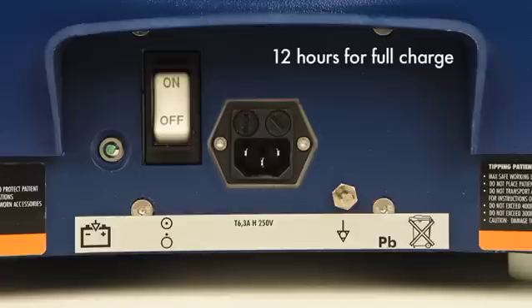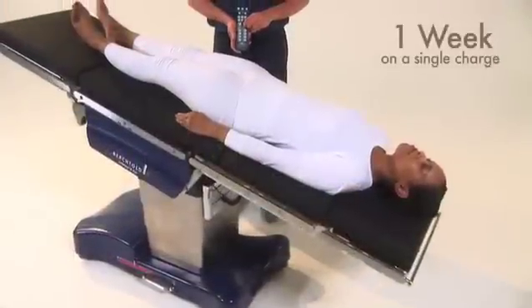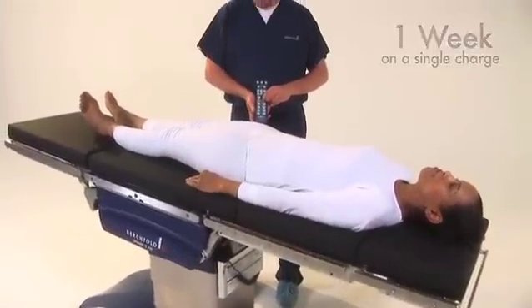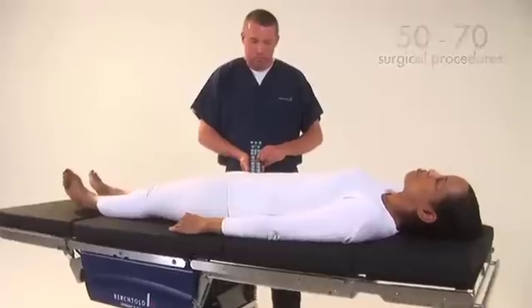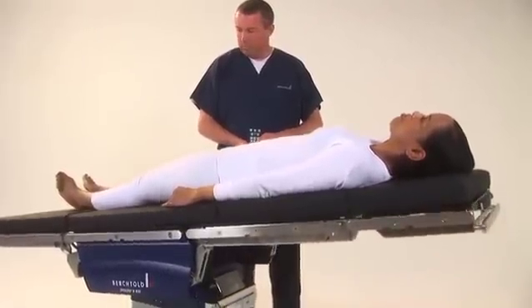The table can be used while charging. The battery should last for a minimum of one week on a single charge and should accommodate 50 to 70 surgical procedures depending on the workload of the individual operating environment.